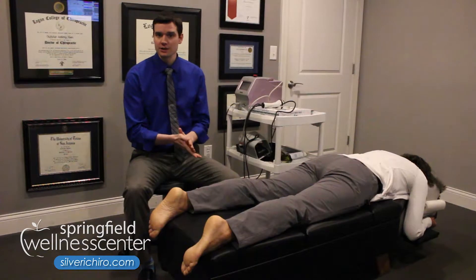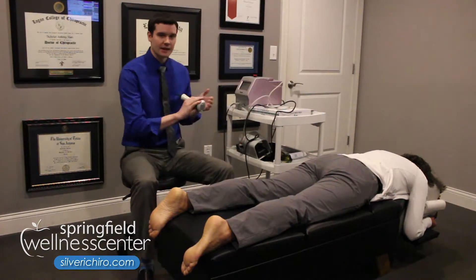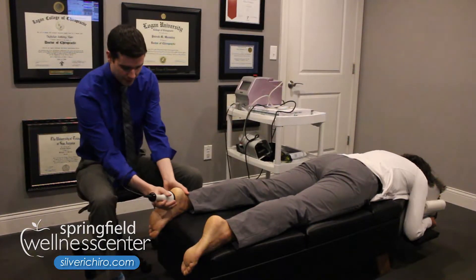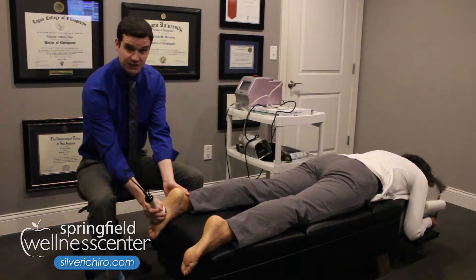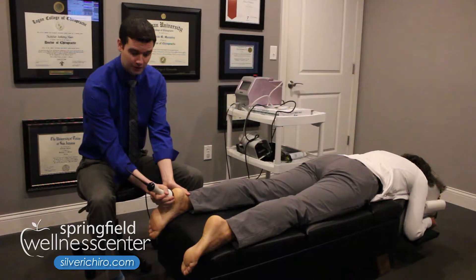We're going to do a little demonstration of what it looks like. It's a very quick procedure that we do. This is the wand here that has the laser light coming through. What we do is we take it on the bottom of the foot and we'll go up and down throughout the plantar fascia tissue here to help expose that tissue to the laser light.